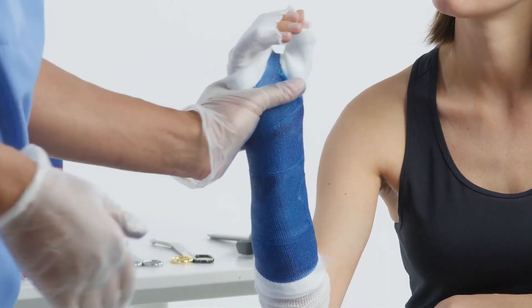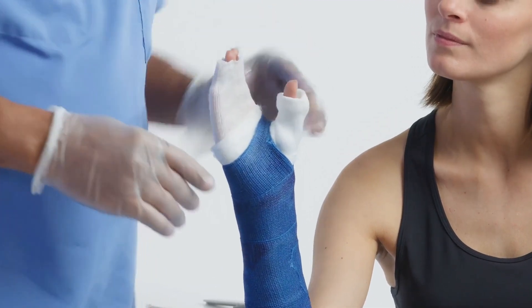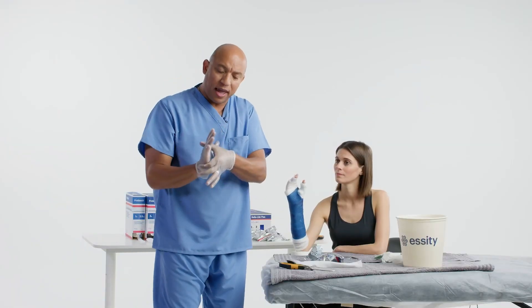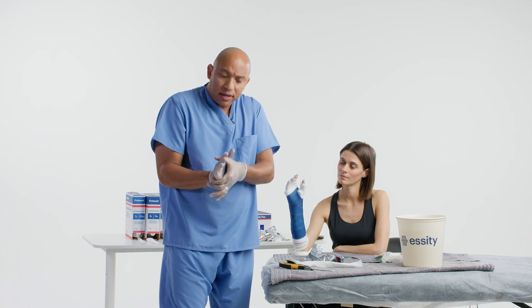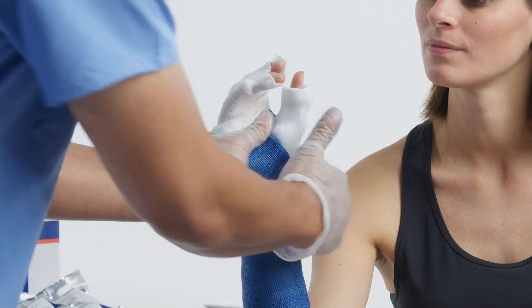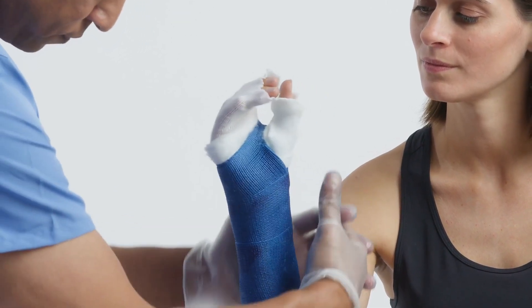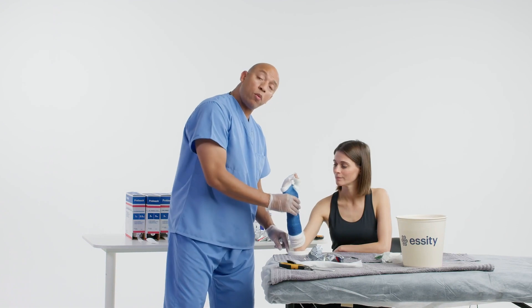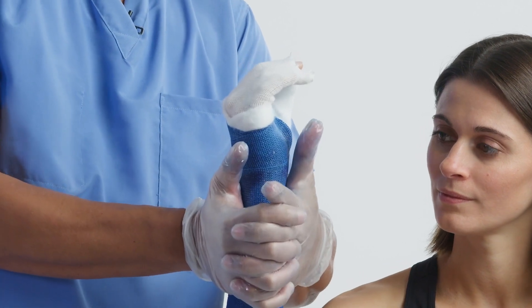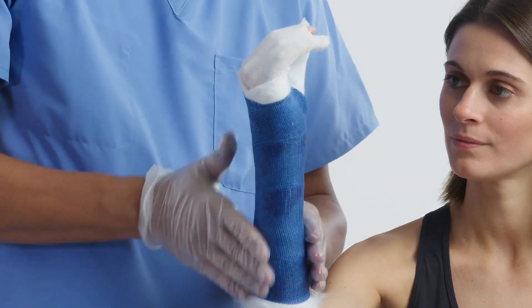If you need to limit supination and pronation completely, you need to add a long arm cast. Another thing we want to concentrate on is the area at the distal palmar crease — we want to take away any space there so when we pull the stockinette down, you don't see a big gap between the palm and the cast itself. I'll just put a little bit of pressure there, and then come back and reapply my molds.